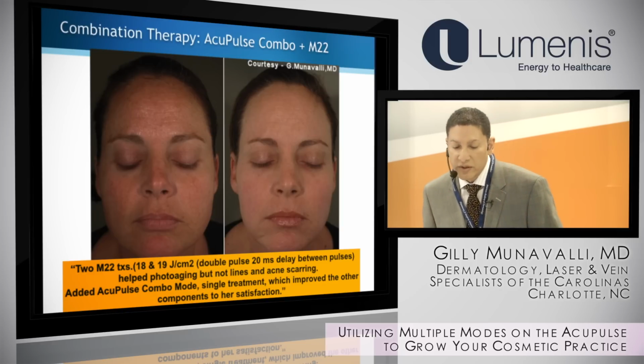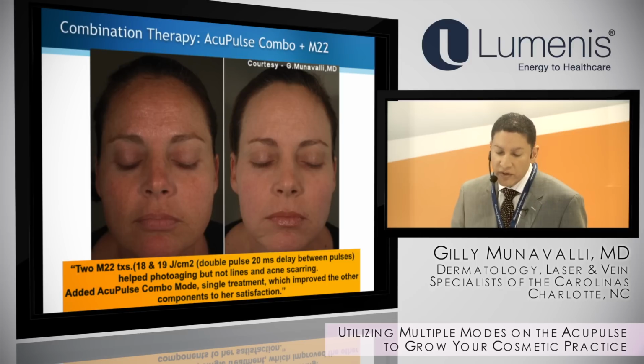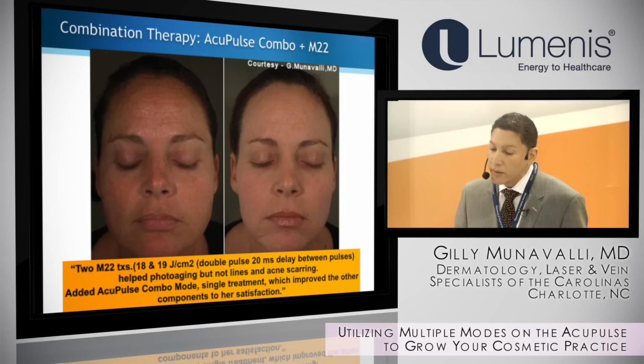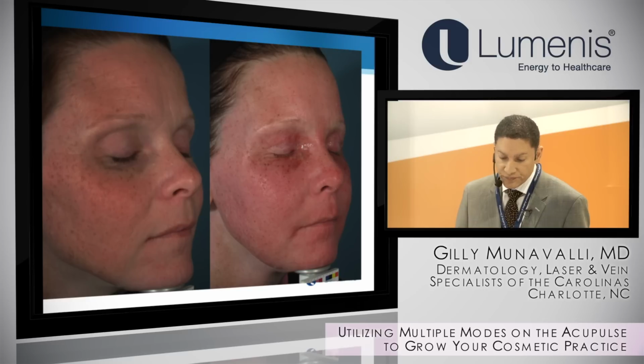We've done treatments using the combination of the combo mode and the M22 mode. This was a patient that had several treatments, worked outdoors in landscaping, believe it or not, and a very attractive lady, but she just had a lot of combination damage. So you couldn't just treat this patient with IPL because you wouldn't get improvement in the wrinkles. But she drove from 3 or 4 hours away. So we actually combined the combo mode and the M22 mode in one single treatment. And I would do the M22 first and then the combo mode second. And she came back and we really didn't need to do much more. She also had acne scarring on her cheeks, so I used the same technique that you just saw, and that improved as well.